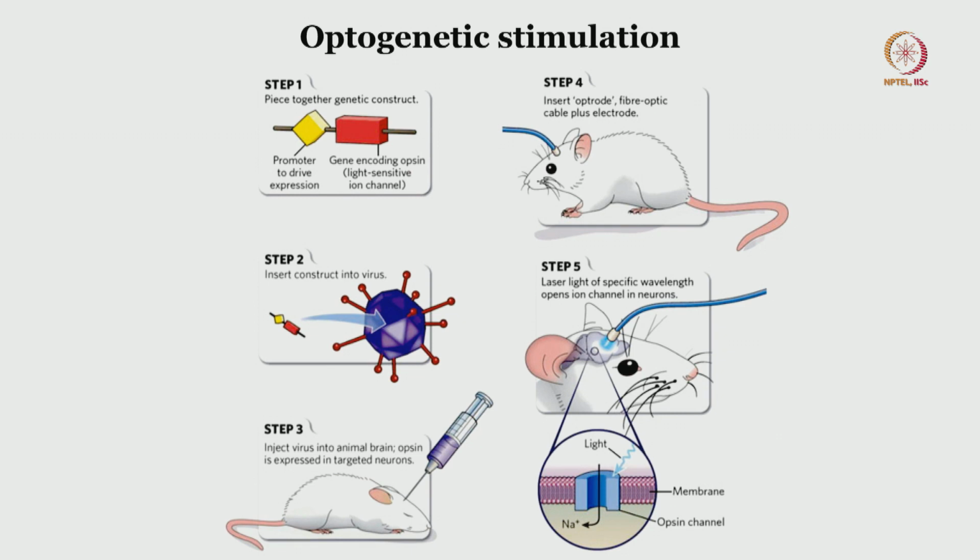You can open and close the channel as and when we need it, and we can study the spontaneous activity as well when the rat behaves in different ways.